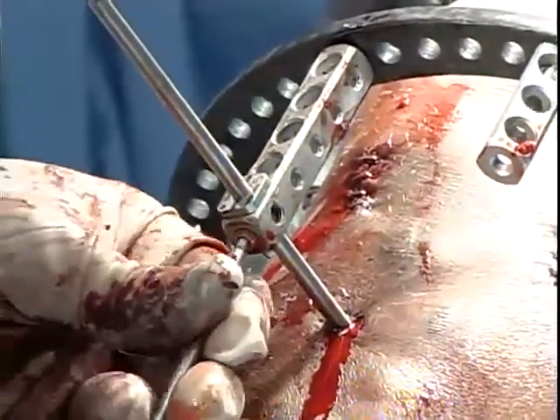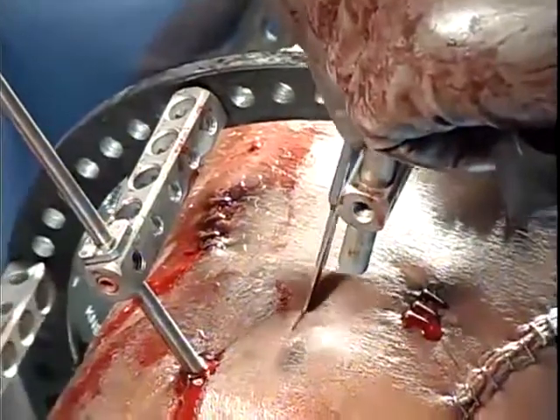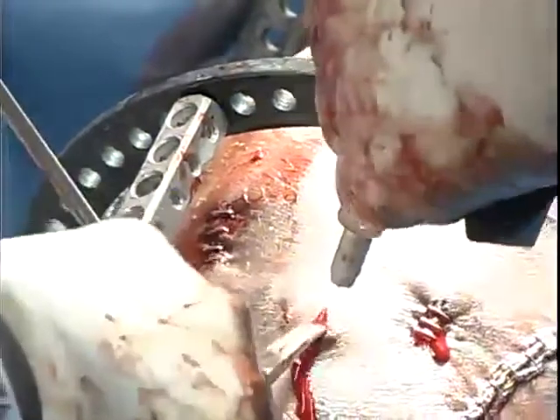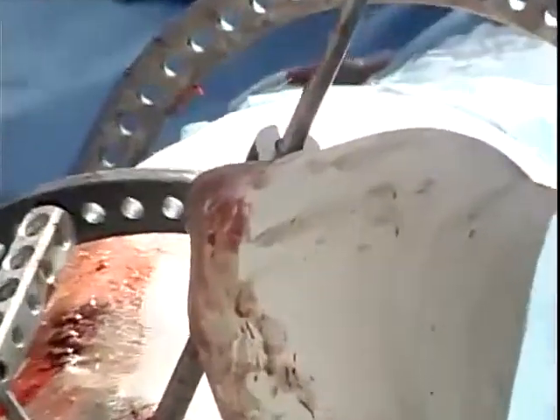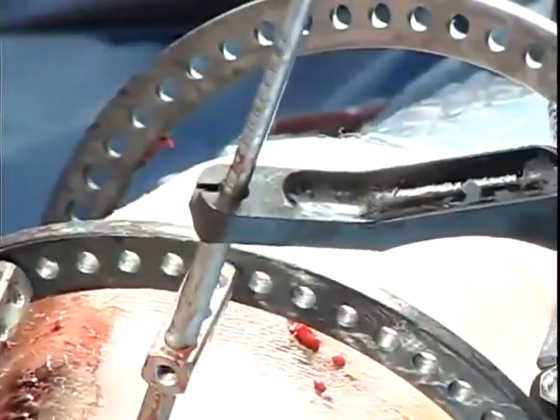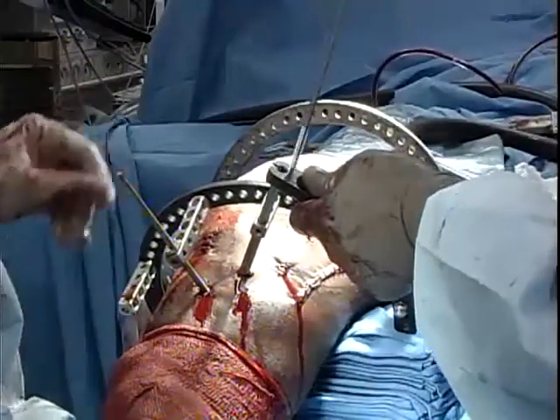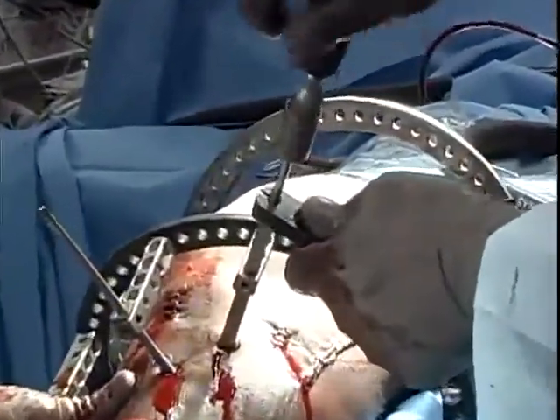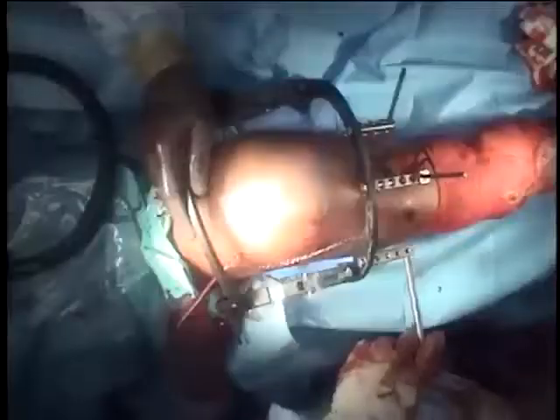Place the centering sleeve on the first Rancho cube and lock with the set screw. For the anteromedial pin, dimple the skin, make a skin-only incision, spread down, pass the triple trocar to tibia, remove the center, and insert the drill bit. Center on the tibia, drill to the far cortex, stop and measure, add 5 millimeters, drill through the far cortex. Remove the drill, select the corresponding pin length, insert it, and drive it in by hand with the quick chuck. Remove the quick chuck and triple trocar, place the centering sleeve, and lock with the set screw.